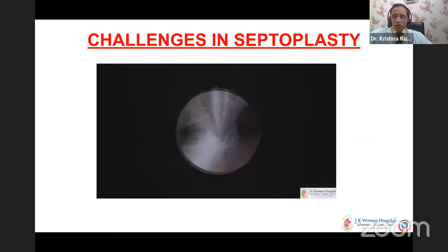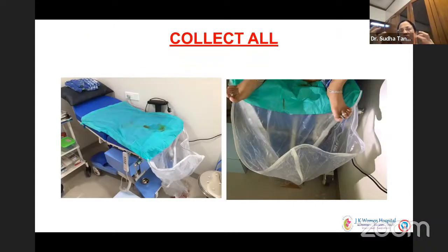At this point, just one point I would like to mention, that to actually measure the fluid, it's not going to happen in a septum, it's not going to happen by and large in an adhesion. It's only in a big submucous fibroid that one has to be really careful. Those cases selectively one can do.